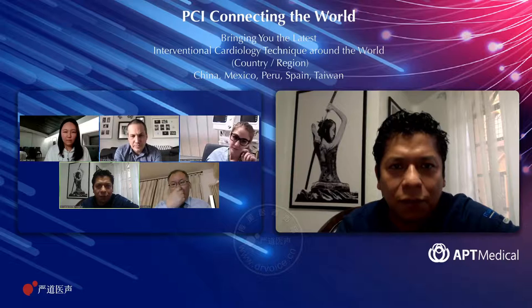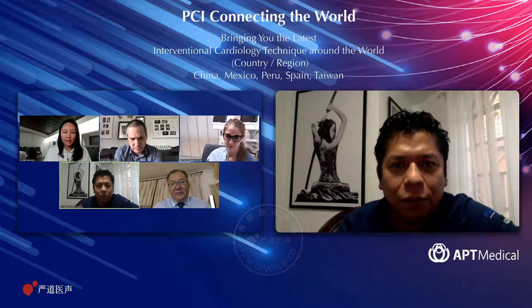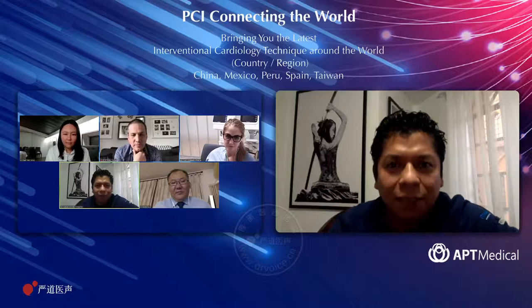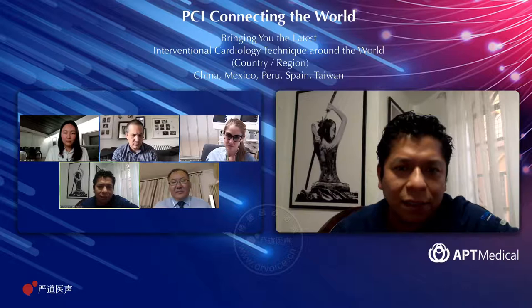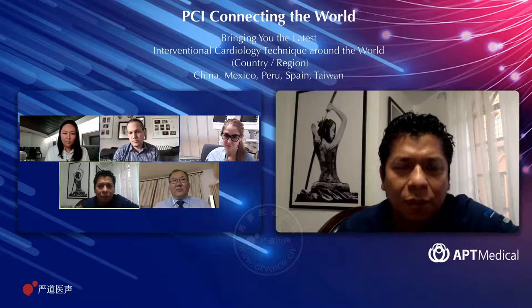Of course, in Mexico, we don't have a dual lumen catheter. We try to use only the old techniques like seesaw or parallel wires with different microcatheters. But of course, we would like to have this dual lumen catheter because I think it's very important. I don't have experience with the APT devices because in Mexico we don't have them now. But it's interesting that with a microcatheter you can generate torque ability to try to advance in the calcifications. How is the performance of this APT microcatheter in a CTO with very hard calcification? Do you have experience with that?